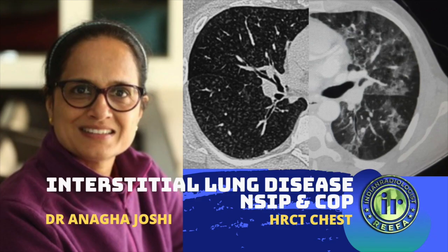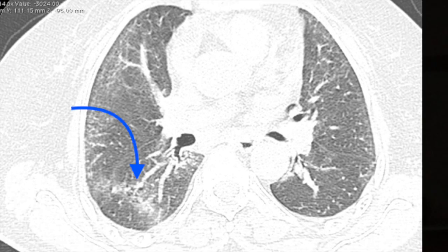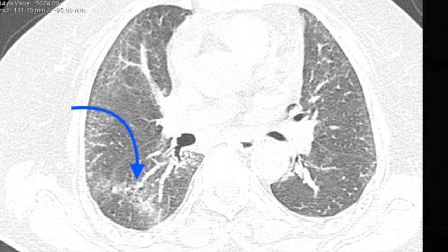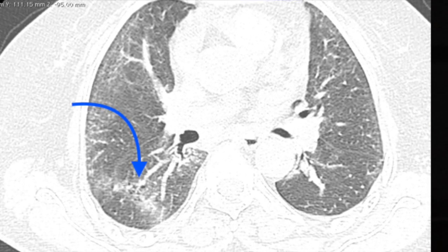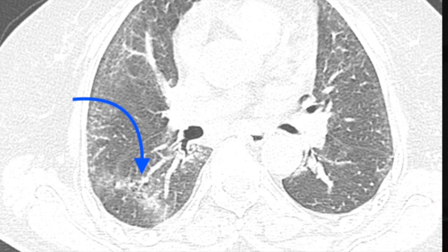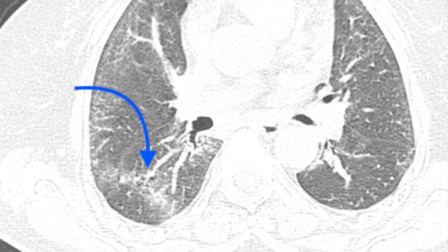Now what pattern is this? This is a different pattern. You have septal thickening and a sub-pleural rim of maybe 2mm sparing, more of ground glass. So intralobular septal thickening, no honeycombing, no traction bronchiectasis. What do you think this is? NSIP.